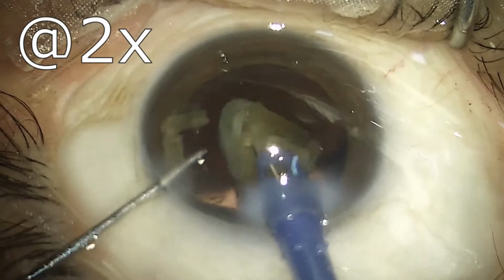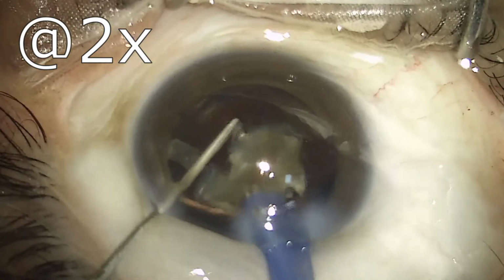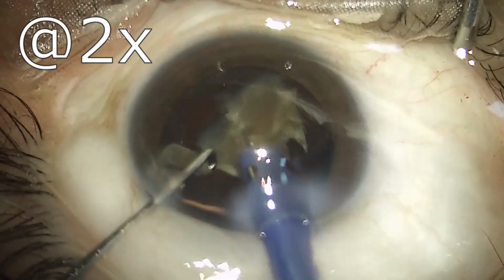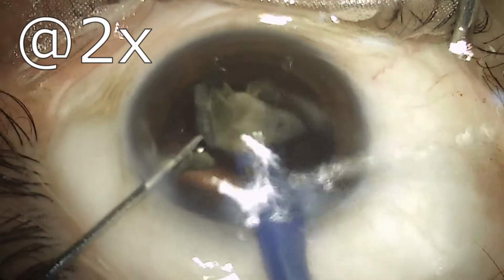So it's better to reduce the aspiration flow if you have a machine setting which allows you to do so by altering the pressing of the foot switch.